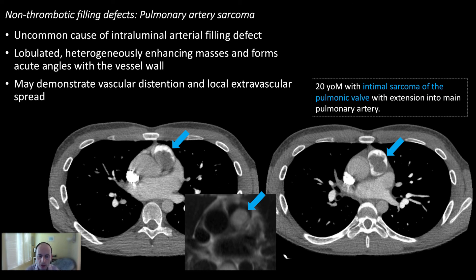This is a patient with a primary sarcoma of the pulmonary artery. Sometimes these can be more elongated and may simulate pulmonary embolism. Clues include lobulated margins, persistence over time, frequently associated pulmonary metastases, and heterogeneous enhancement of the lesion even on CT — all clues that this is not simply a pulmonary embolus.